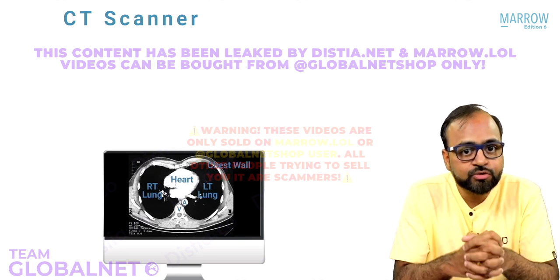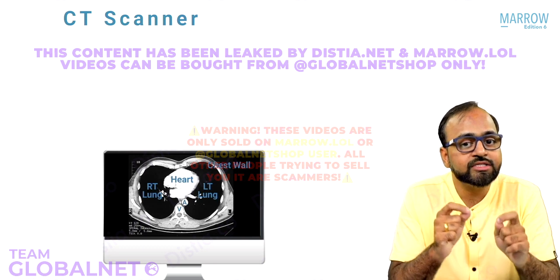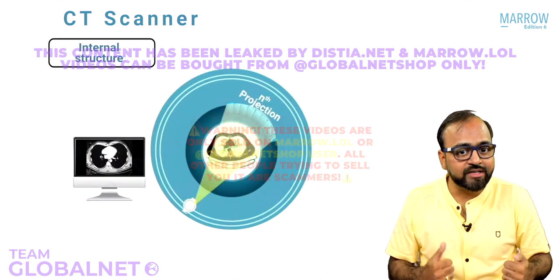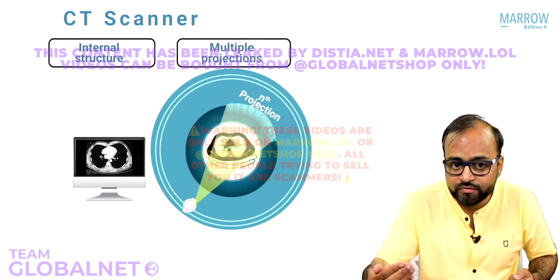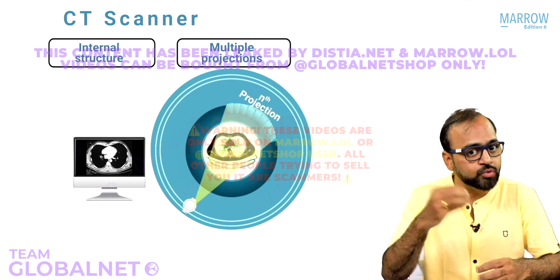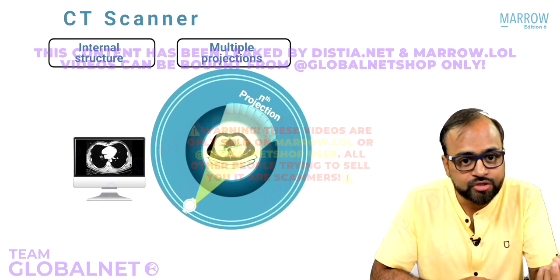So what is this image actually showing you? This image is actually showing you the internal structure of the patient's body, isn't it? But from what data have I reconstructed this internal structure? I have got this internal structure from the n number of projections of the patient's body, isn't it? So data from n number of projections is used to show or display the internal structure of the patient's body.